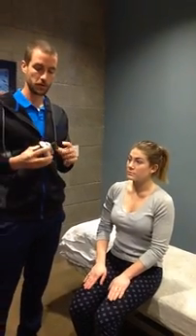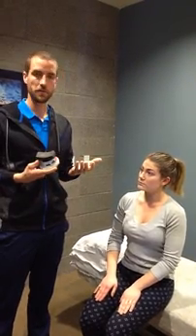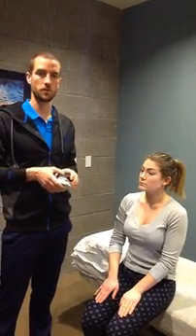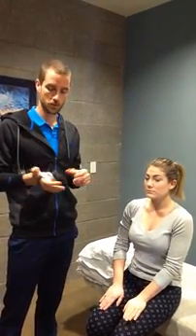Alright, so what we're going to be going over here is the use of the handheld dynamometer for both the shoulder and the hip and knee. This tool has been shown to be very reliable. It's not necessarily the most valid, but what we're trying to do here is create interrater reliability between all of us, so we're all doing it the same. So we're going to go over the different muscles, and then we'll also be going over this in person so you get used to using it.